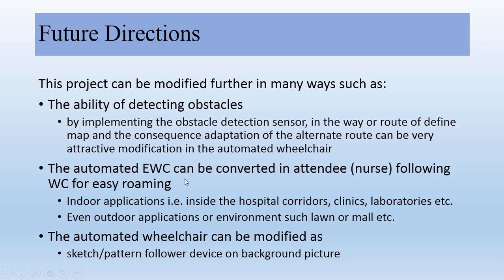Similarly, the automated electric wheelchair can be converted in a nurse following or attendee following wheelchair for more easy roaming.